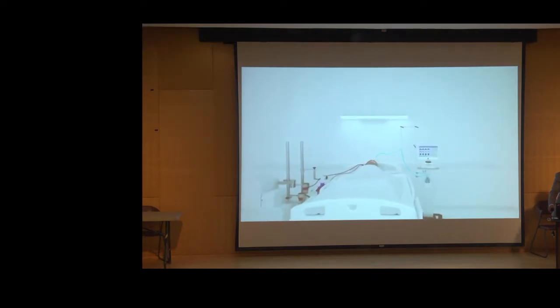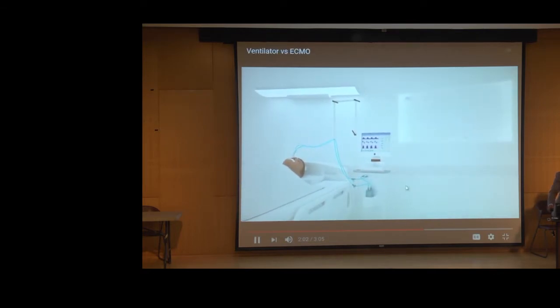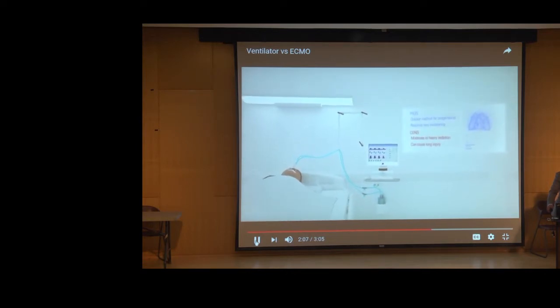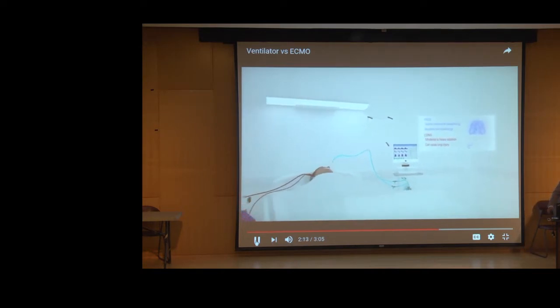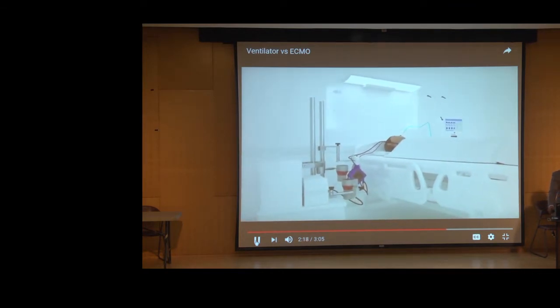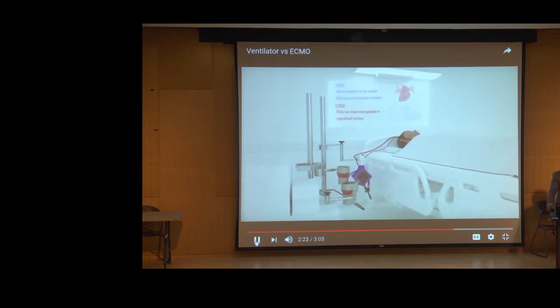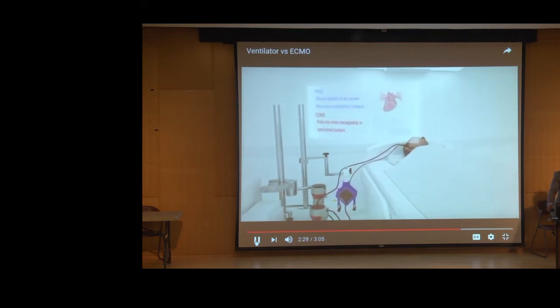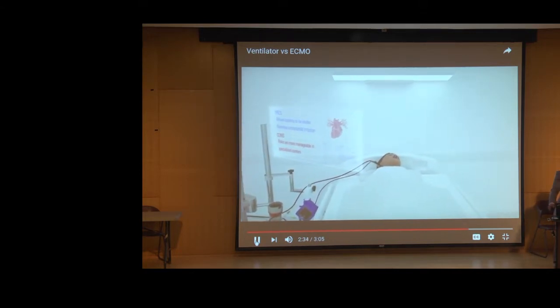As with most life-saving techniques, ECMO and ventilators each come with pros and cons. Mechanical ventilation is a quicker method for oxygenating a patient. Standard ventilation requires less monitoring than ECMO, but it does come with moderate to heavy sedation and can cause lung injury at high pressures or oxygen concentrations. ECMO allows patients to be awake and moving during their treatment. By eliminating the breathing tube and ventilator, it removes a substantial irritation that drives the need for sedation. ECMO is not without its risks, but these have become more manageable in specialized centers.